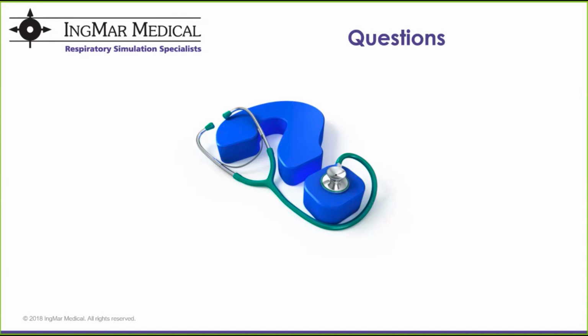Here's another question. William asks, where do you create the change states in the LEAP software? The environment used to create the theme, as we demonstrated today, is called Sim Designer. That's the environment used to create themes as well as scenarios, so that's where you would need to go for that. Glenn asks, I'm guessing that nothing limits us to themes rather than scenarios. Yes, that is absolutely correct. You could take a very similar approach to what we did today using a scenario rather than a theme.